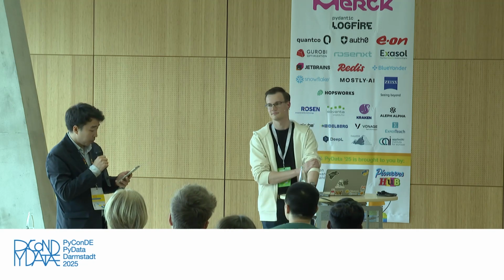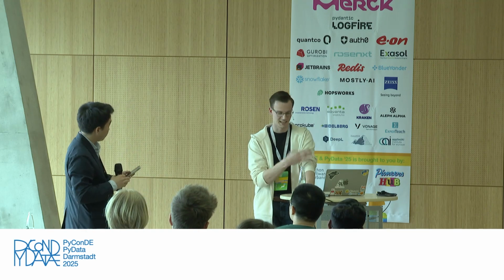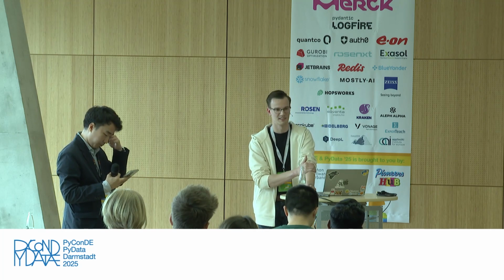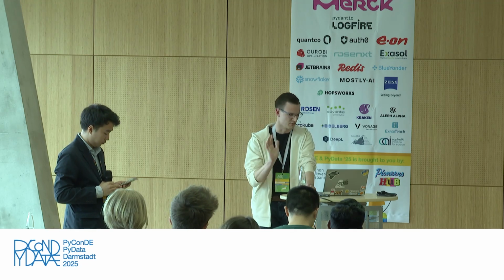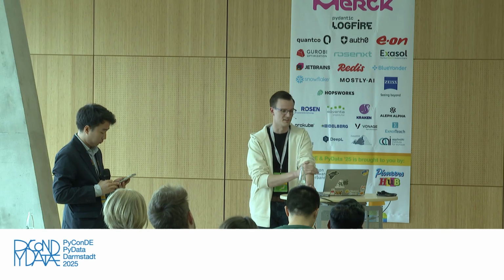Why can't you turn the image into a grayscale image and then use it for your model? As I just mentioned, I also tried grayscaling. Sometimes the results are comparable, sometimes they are even better. The model is, of course, faster, but only by around a third. But sadly, most of the time, the results are actually worse with grayscaling.